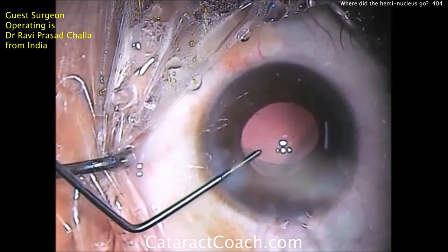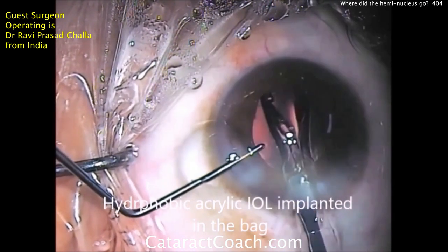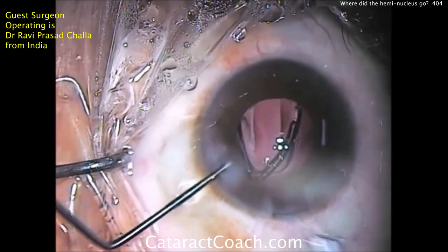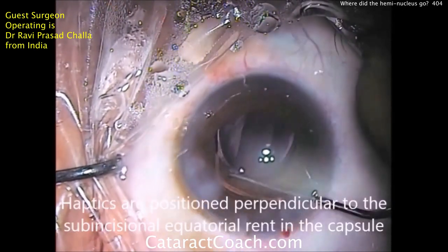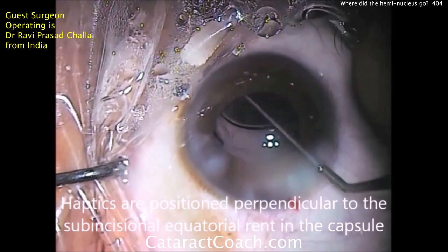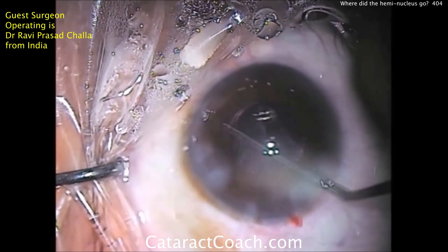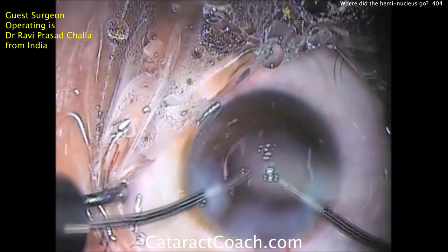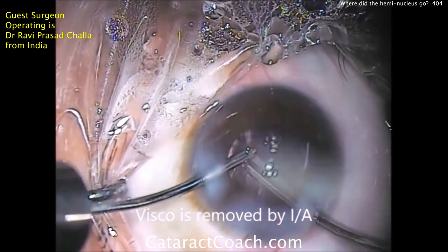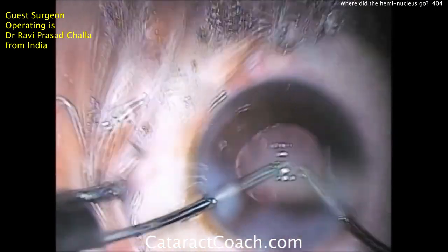There's the viscoelastic being put in the eye. What are your options here? He's going to do a hydrophobic acrylic single-piece lens in the capsular bag. As long as you rotate it 90 degrees away from that defect, you'll be okay. Other options would be a three-piece lens in the sulcus, again with the haptics rotated 90 degrees away from the defect. And finally, at the end, the viscoelastic can be removed.